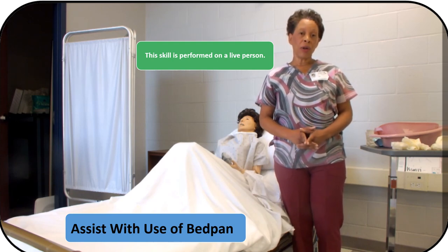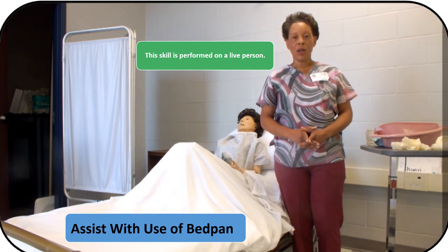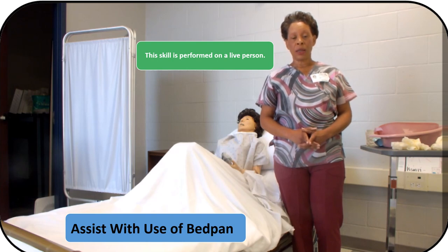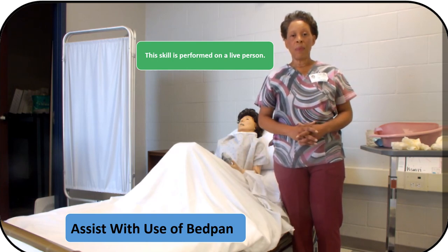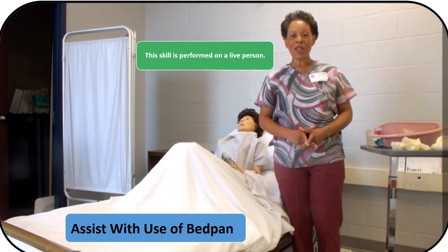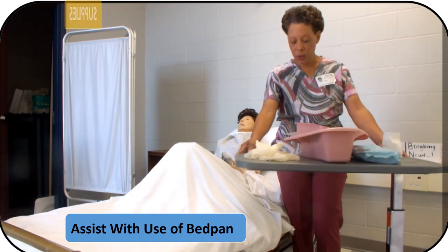Because this is a training video, I insist that you train along with me. So as I gather my supplies, I want you to gather your supplies. And as I do each individual step, I want you to do those steps right along with me. So let's go ahead and look at the supplies that we will need.